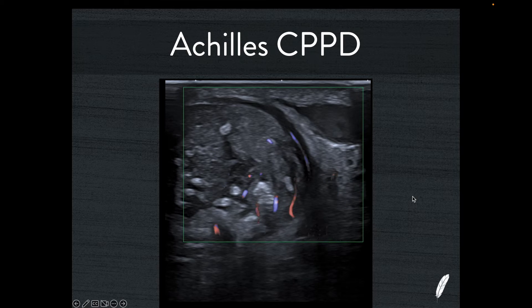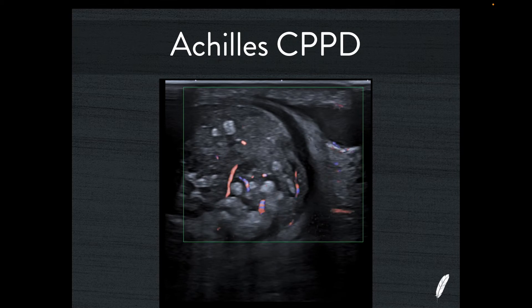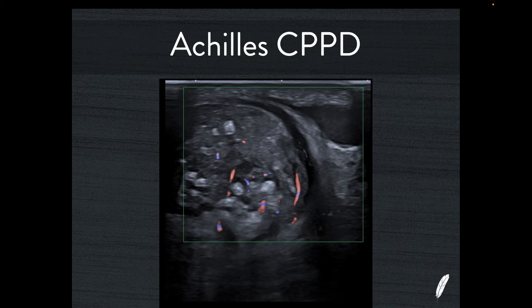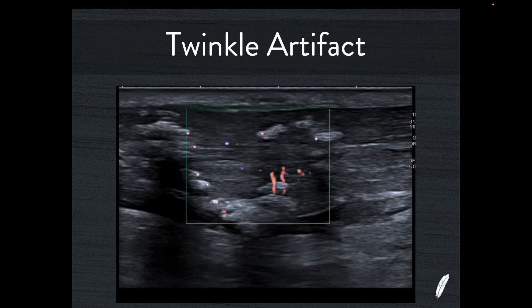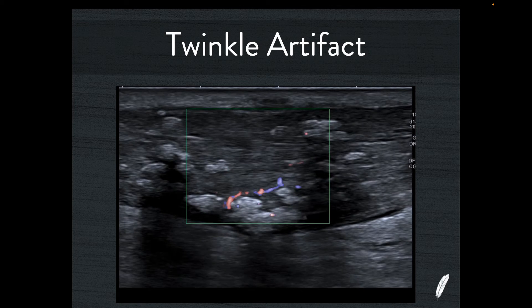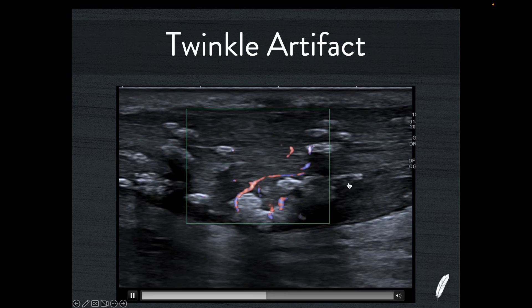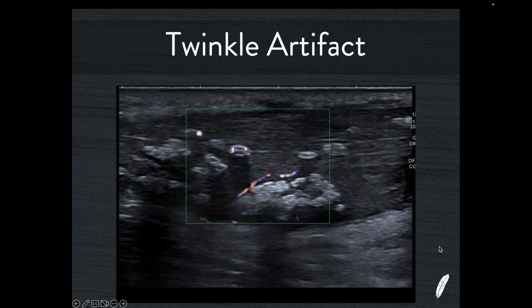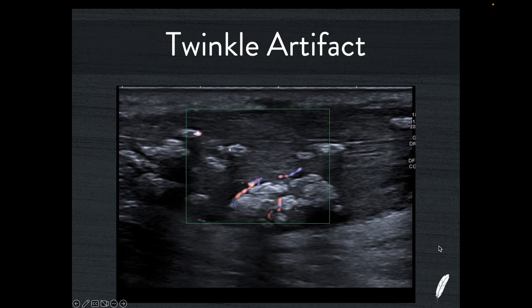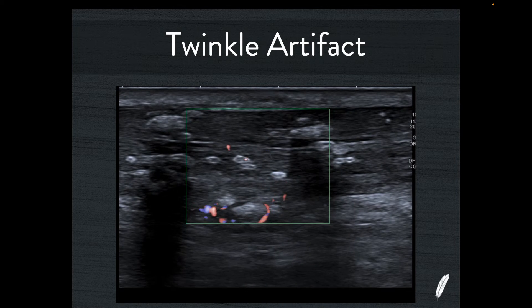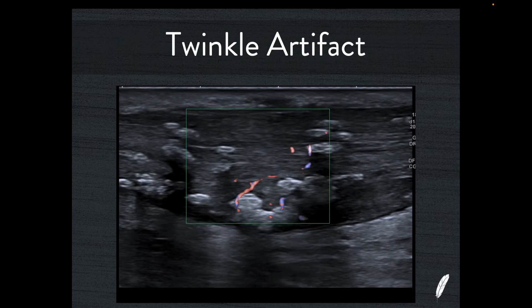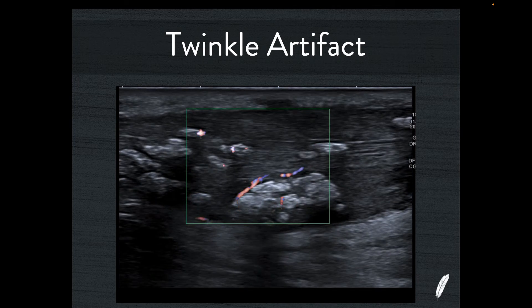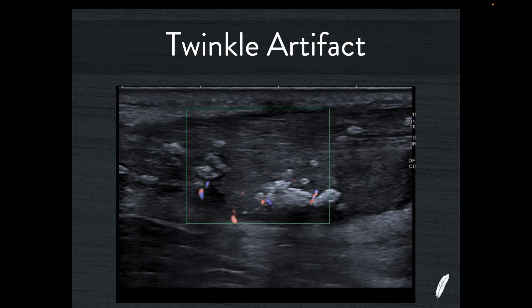This further proves that the fat pad around the Achilles and the peritenon are involved in an inflammatory response. In long axis, you can see vessels coursing through the collagen. You can also see occasional twinkle artifact — this is not real flow. Twinkle artifact must be caused by something crystalline in nature. CPPD — calcium pyrophosphate dihydrate deposition — certainly ticks that box, and so this is another clue that we're dealing with CPPD.